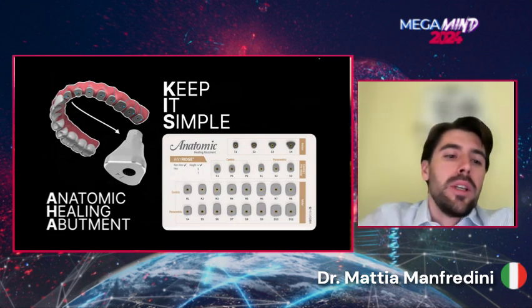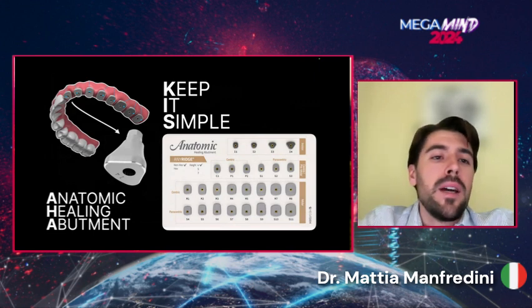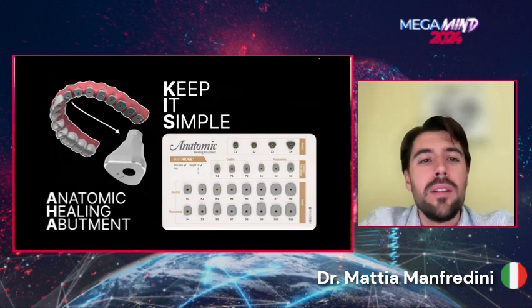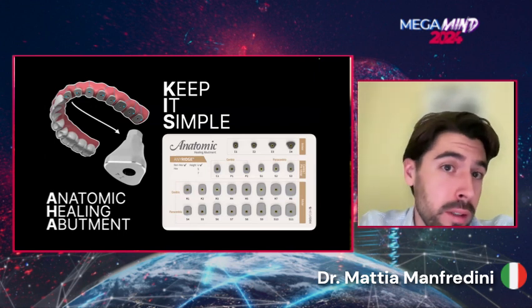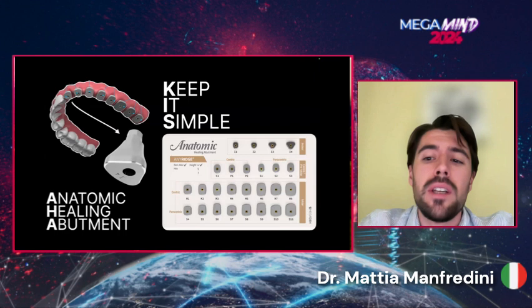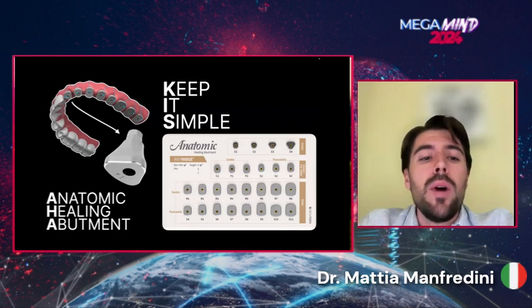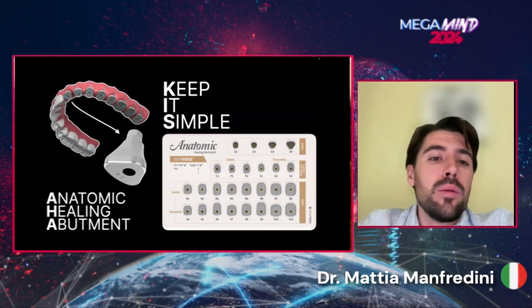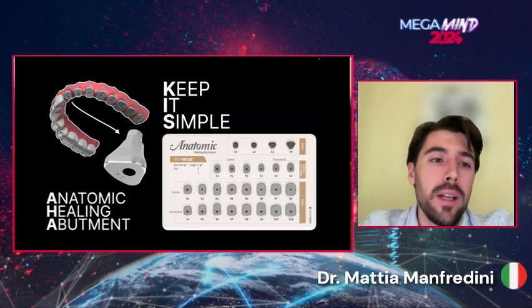So we discussed this technique in the post-extractive sites, and the answer is easy to understand. Is there a way to keep the advantages of this technique without customization in post-extractive implants, because it takes time, of course, and be able to use this technique also in native bone as well? Well, the answer to solve this problem is the introduction of the anatomical healing screw into our clinical practice.